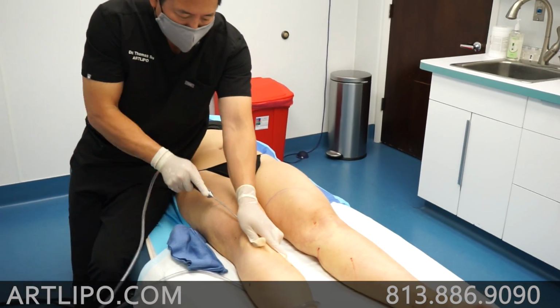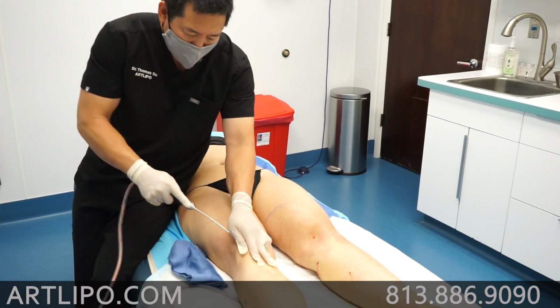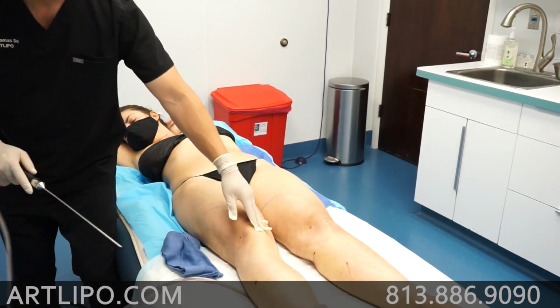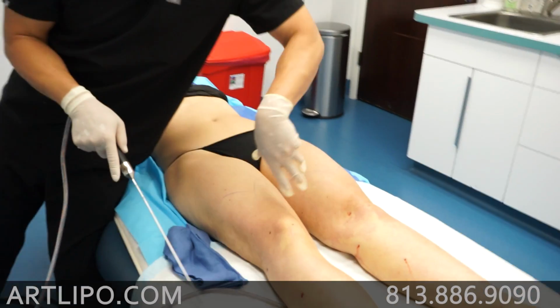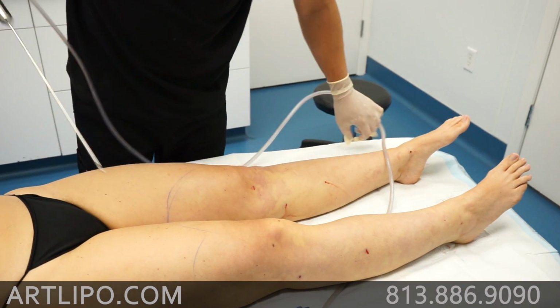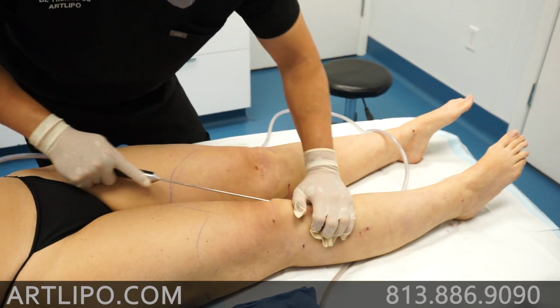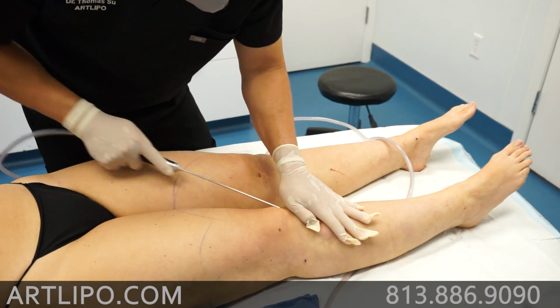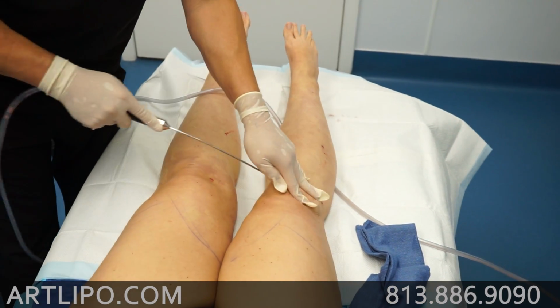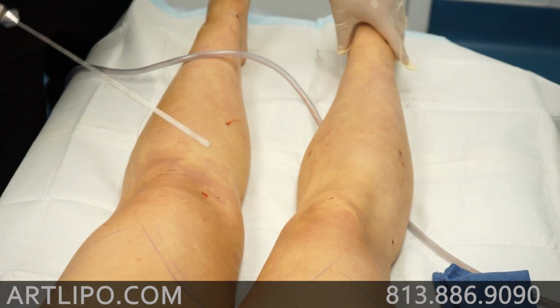So these areas working around the knee are very uncommon for other doctors to do. They are very fibrous, and they do require a bit more effort to break that fibrous fat free. Okay here, Mary? Perfectly fine. All these areas around the knee, which are these little bunchy bulges of fat, can all be treated.